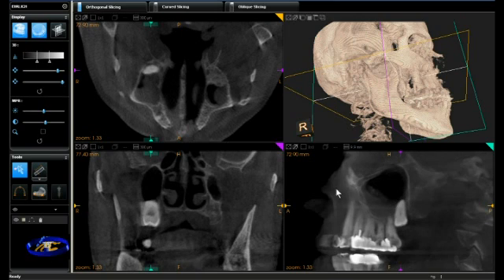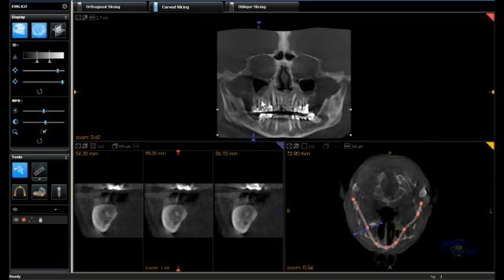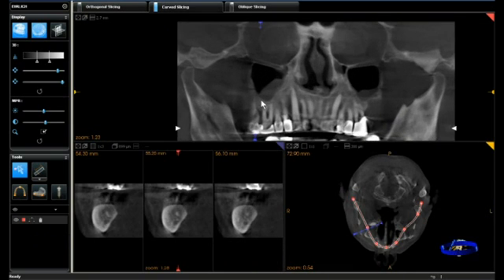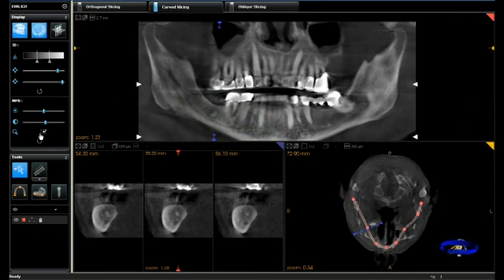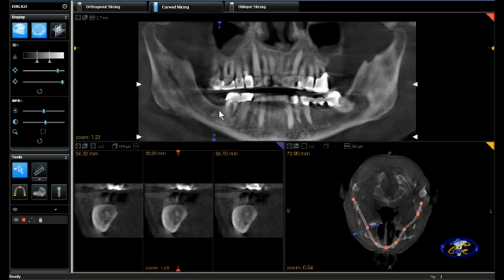The sagittal view clearly displays some mucosal thickening as well as some fluid in the sinus. Using the curved slicing tab we're able to reconstruct a panoramic projection. An incidental finding is what appears to be a retained root tip in the lower right mandible.